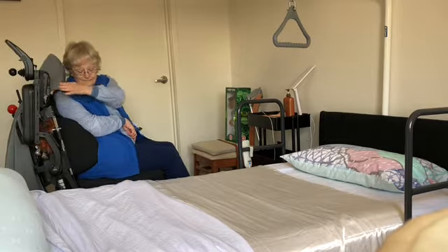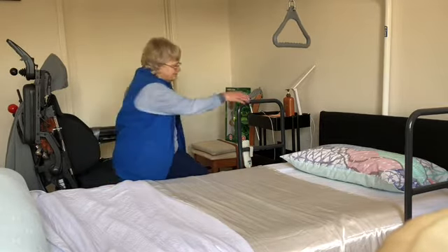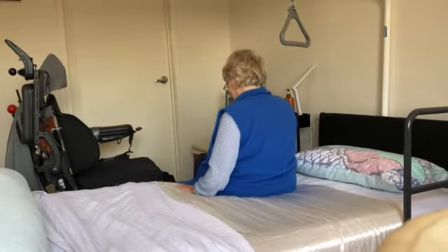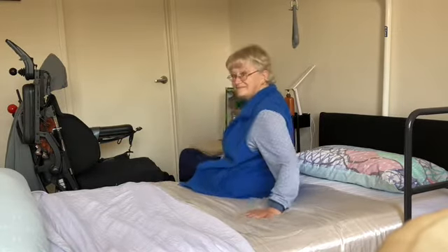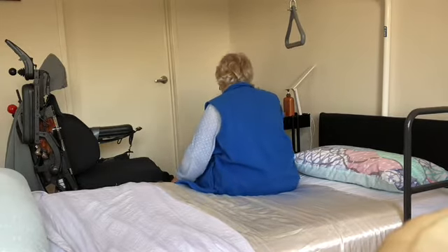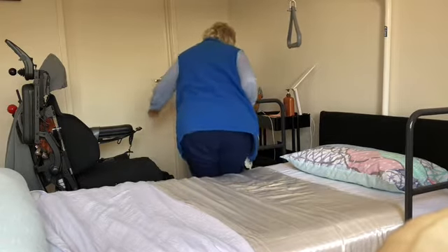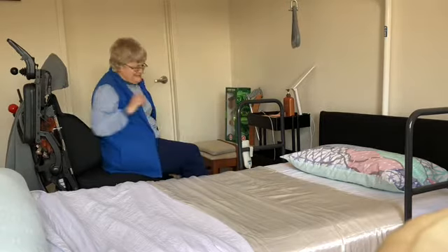Now I'll show you how I can transfer onto the bed — very simple if I've got it down low enough. And I can get out of the bed reasonably easily too, which I couldn't do with my previous bed because it was far too high.